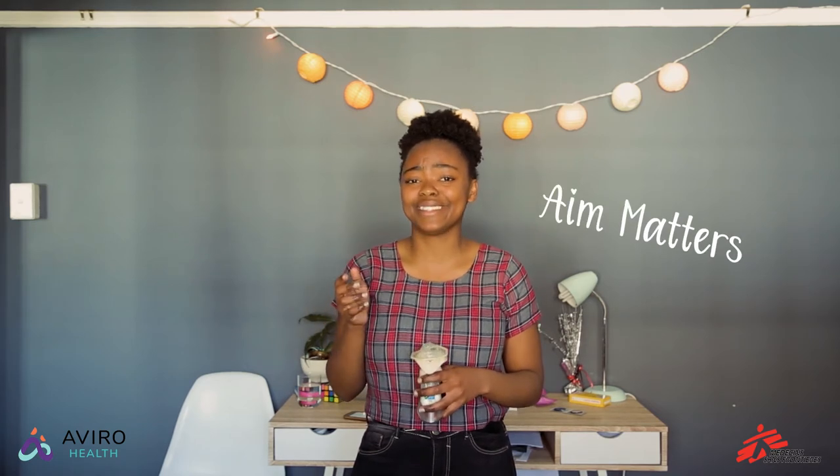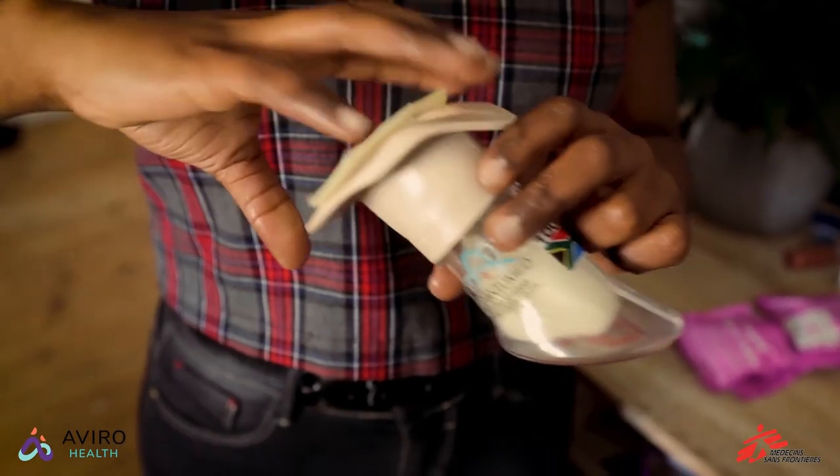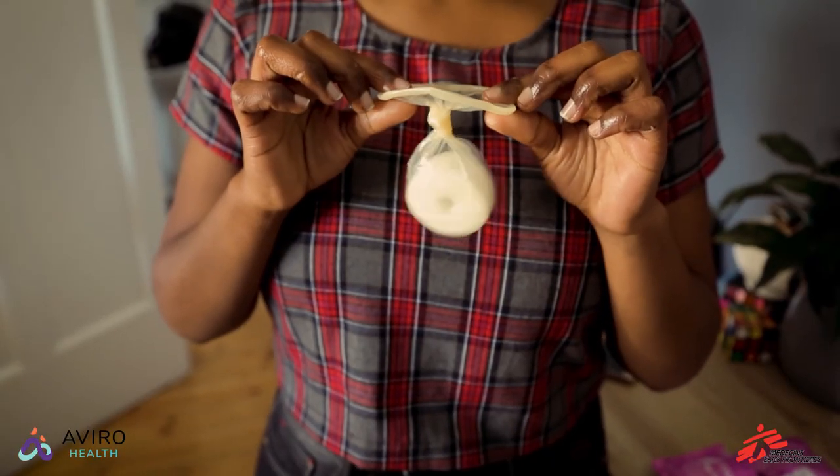When you and your partner are having sex, make sure he goes into the female condom and not on the side of it. Now when you're done, twist the outside of the condom to close it shut and then gently pull it out.